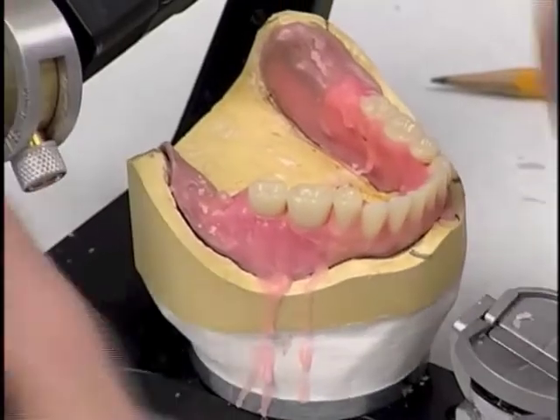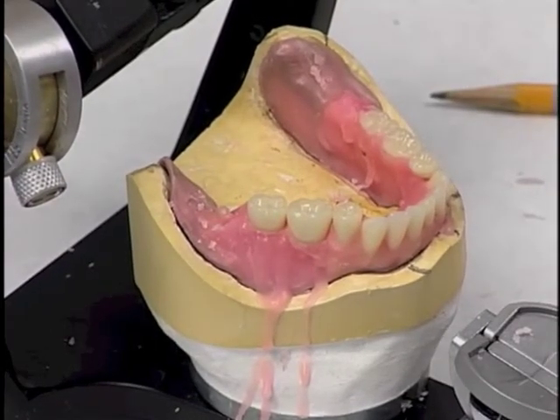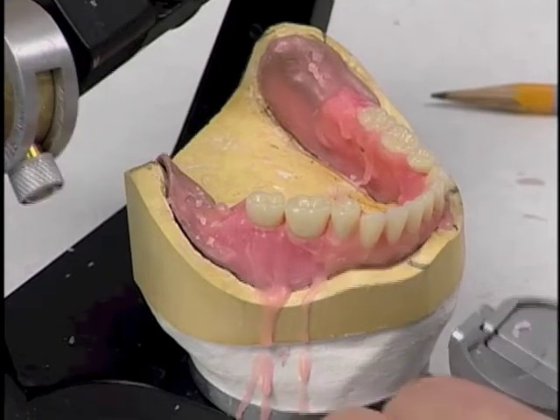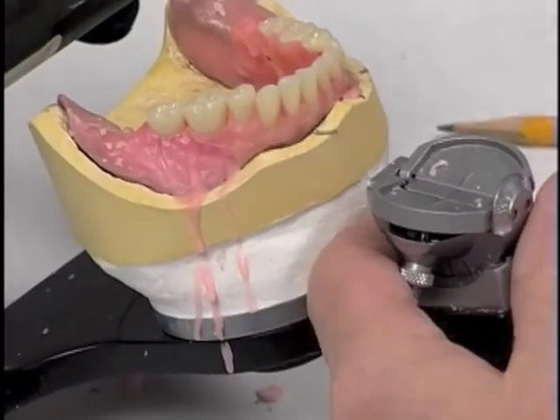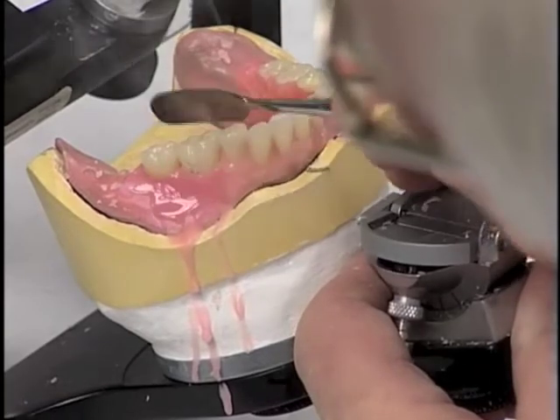The next thing I want to do with this is stabilize all of these teeth and allow that wax to set till it's fairly hard before we attempt to place maxillary teeth. And the reason for that is, in placing the maxillary teeth, if the mandibular teeth tend to move on you, you're going to mess up the entire posterior arrangement. So we're just going to stabilize it.